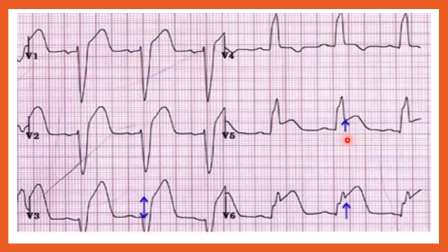So it looks like in this EKG, we've got some pretty major issues going on, the ST elevation along with the left bundle branch block. Now, I don't know whether this bundle branch block is old, so the patient has had it for however long, or it is new in the face of this MI. And if it's new, again, mortality rate goes up, heart failure, lethal dysrhythmias, the need for pacing, all of that increases.